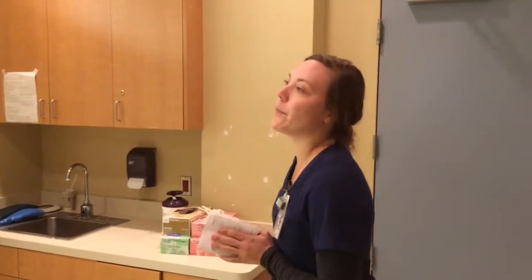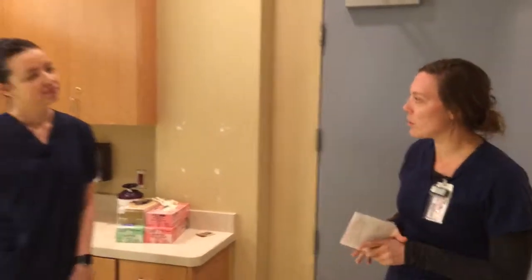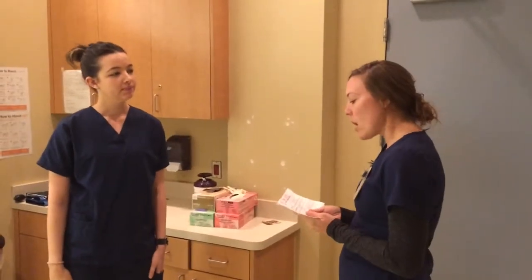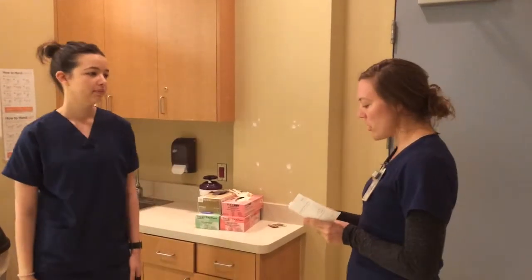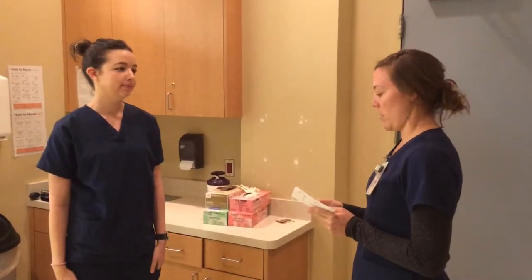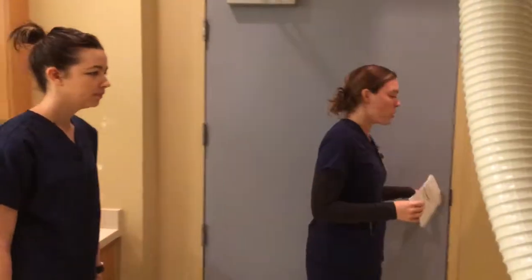Miss Stump? Yes. Hi there. I'm Judy from the X-ray department. We're going to be doing your X-rays today. Can you verify your first and last name for me, please? Kylie Stone. Okay. And when's your date of birth? November 8th, 1991. Okay, great. So right this way. You're going to come into this room.